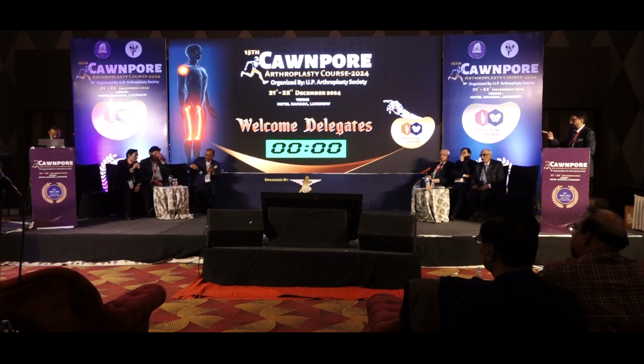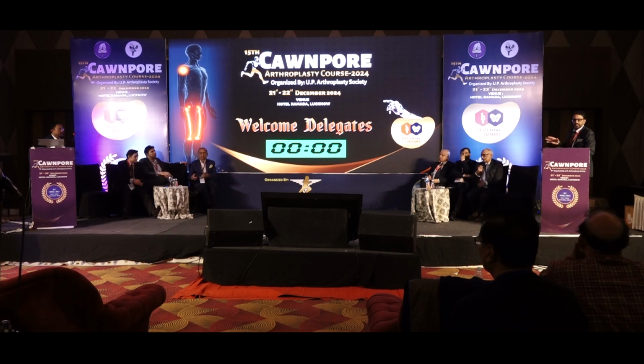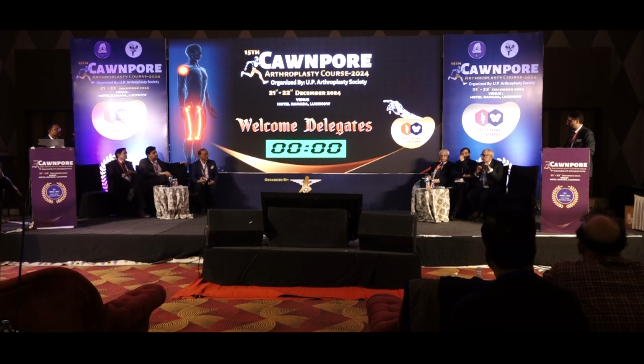So you can double check by using an IM as well. You may double check, but for me, I don't think that is very precise, especially in the Indian population. I just wanted to draw your attention that the incidence of subsidence is low if it is along the native line.